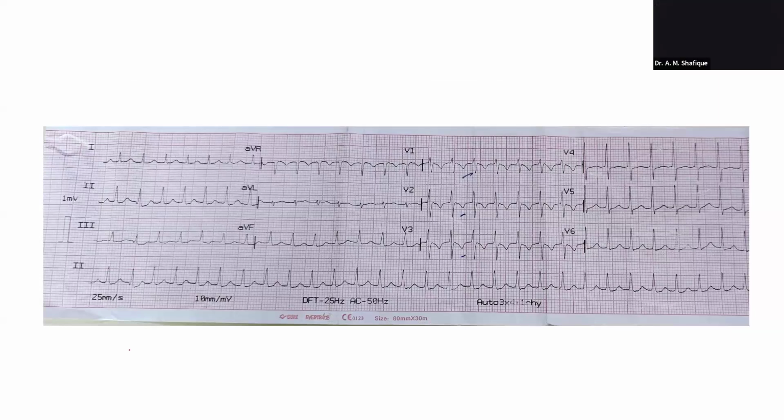Patient developed ventricular fibrillation, ventricular tachycardia, and ventricular fibrillation as well, after getting verapamil. So far they witnessed, we were not there. The emergency medical officers were there. So no cardiologist at the time of giving CPR or verapamil. So it is not witnessed properly.